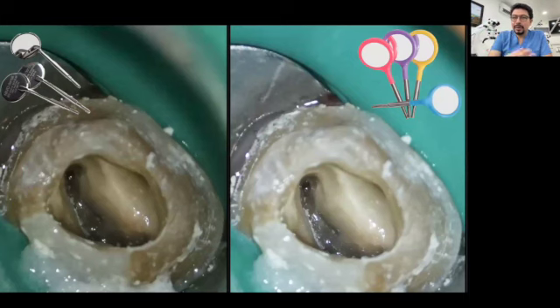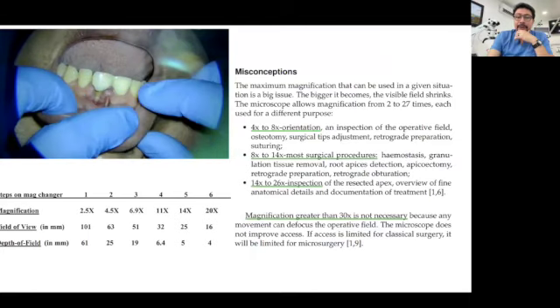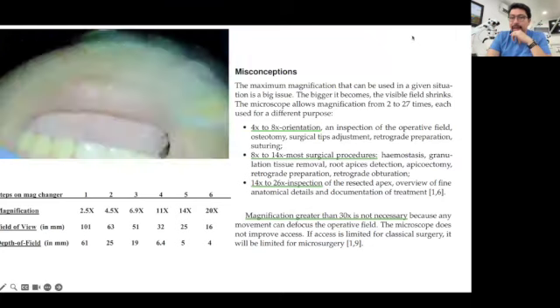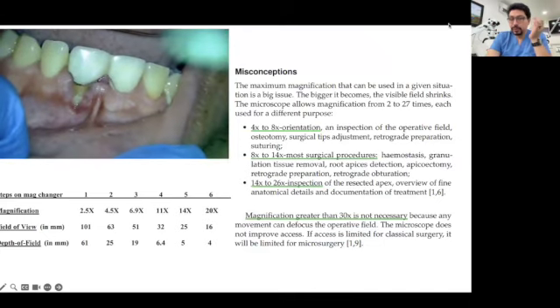But if you take proper care of them, maybe you can protect them with a gauze before taking them to the sterilization process, and you can notice the change. You have a much better illumination inside of the pulp chamber when you have an HD mirror, compared to cheap mirrors or other types of mirrors. Just give them a chance. So this is very important, guys. It's very important to understand what steps of magnification we are going to use.